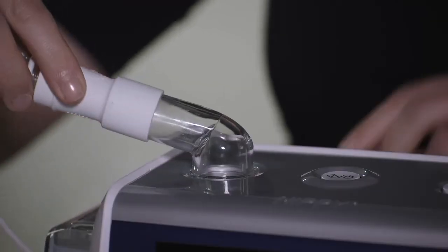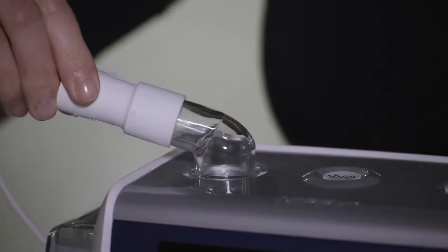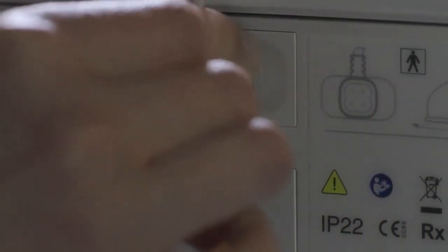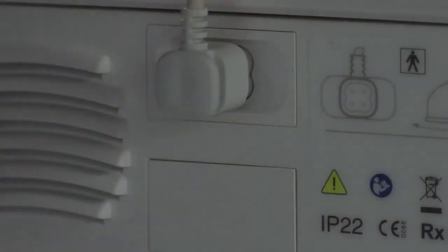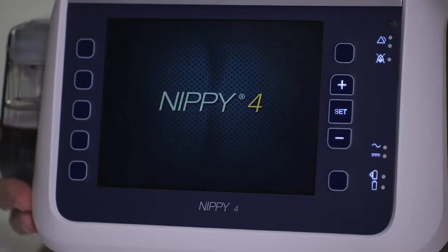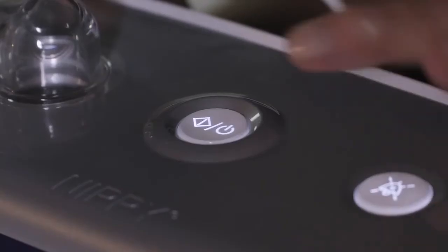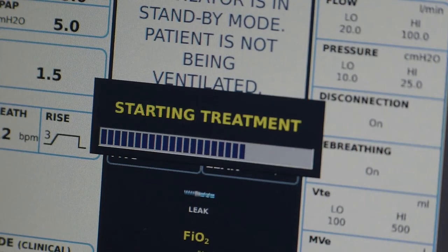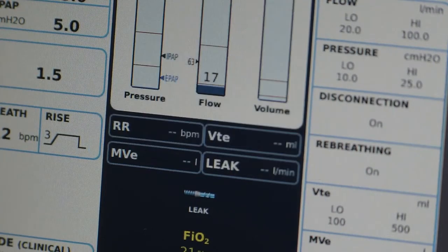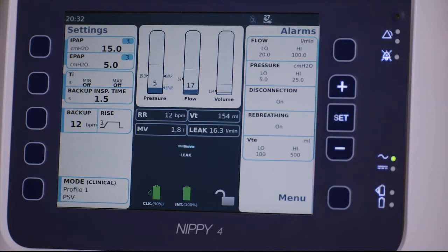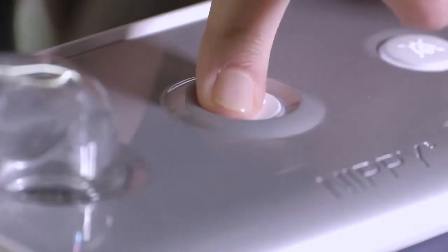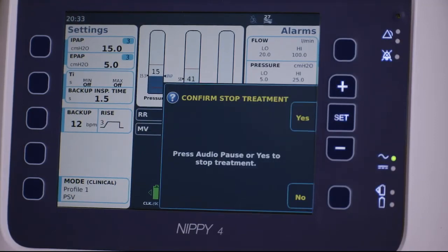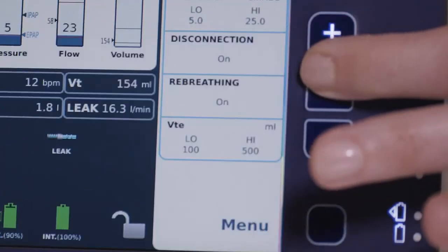To begin treatment on the NIPPY 4 and NIPPY 4+, connect the patient circuit and press the start/stop button on top of the device until the progress bar is filled. To stop treatment and enter standby mode, press the start/stop button until the progress bar is filled and confirm stopping treatment by pressing set on the main screen.